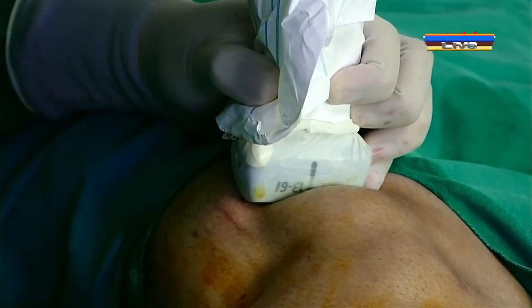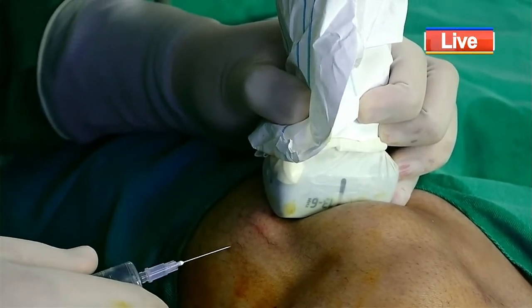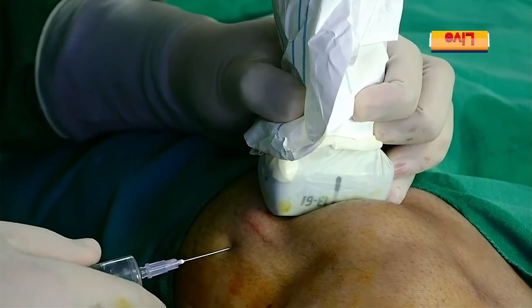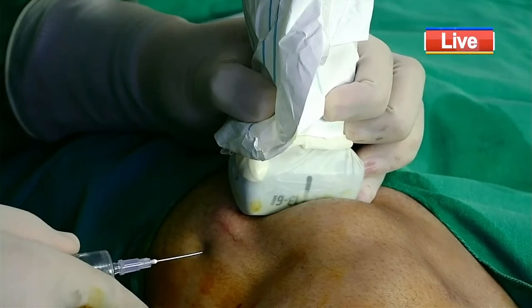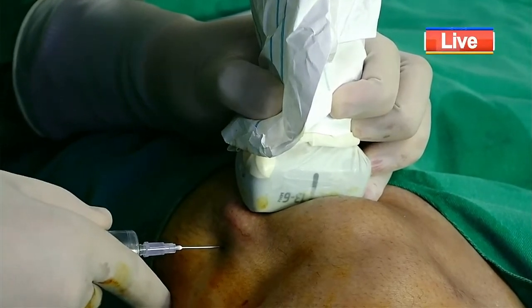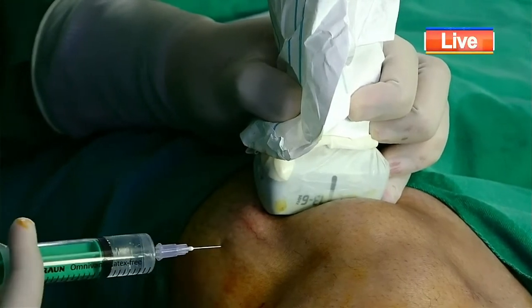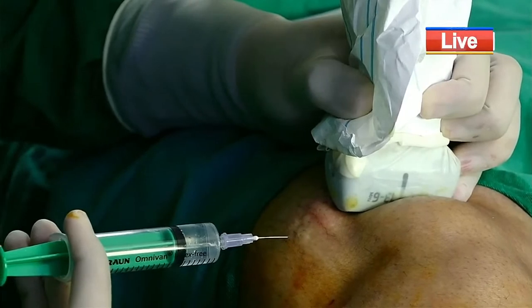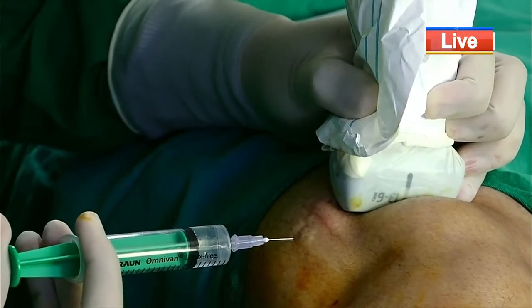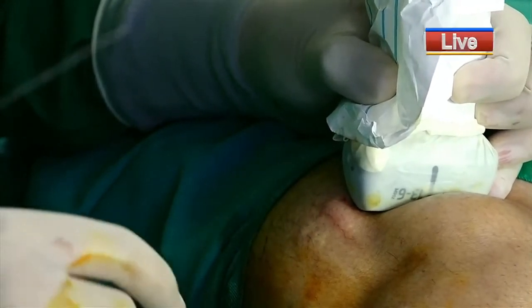So this is my local needle. Now I am going to give a very slight prick at this level. I should not go much deep because the recess is very close. So just give a little bit of local, raise a skin wheal and then deposit some in the subcutaneous plane, and that's it. You should not aim to go very deep, and we are done.